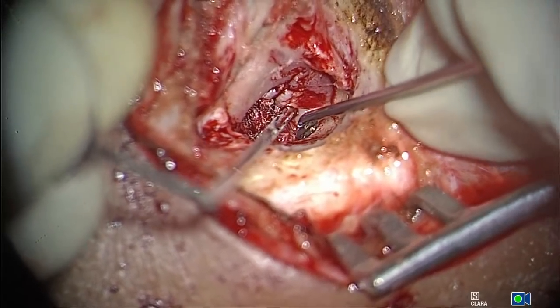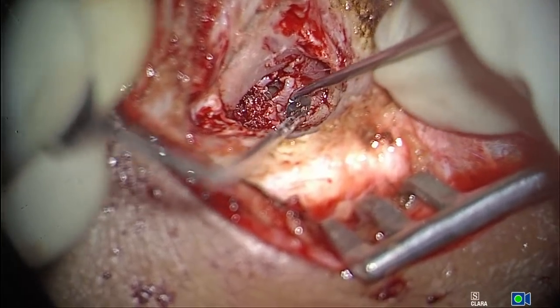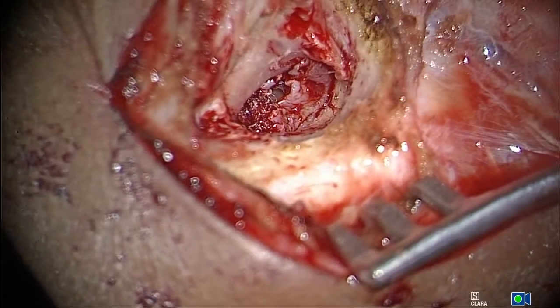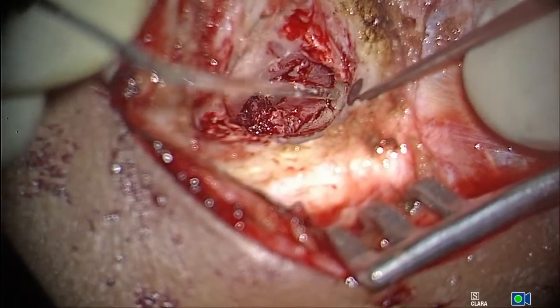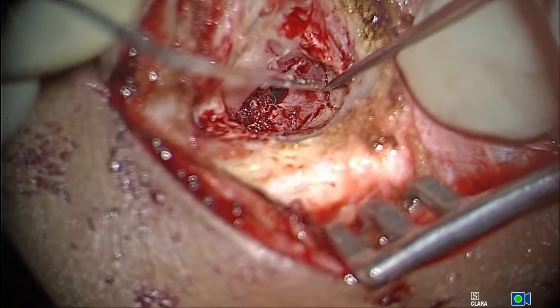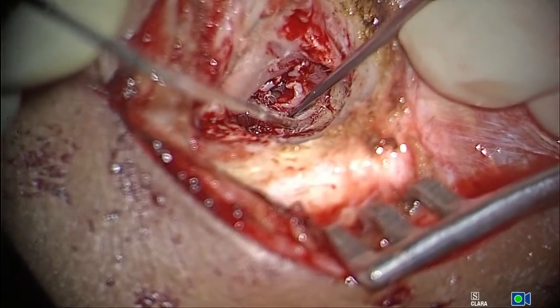Of course, you see how the Henle spine drilling actually helped me in visualizing the posterior aspect of my elevation. Can you see that? Is it seen clearly? You can ask the audience how many people are watching. Good, that's a good number. But the next case is a very interesting case of cholesteatoma.